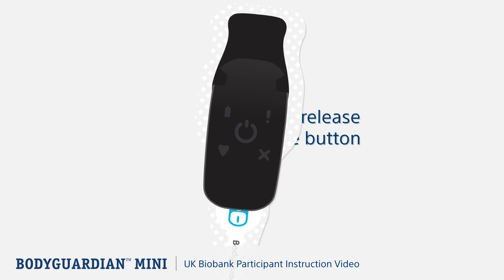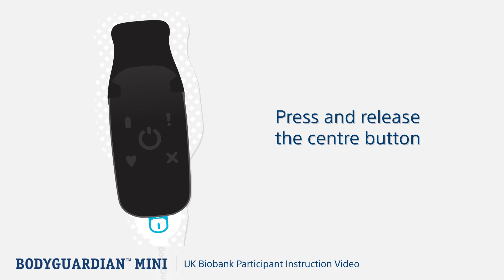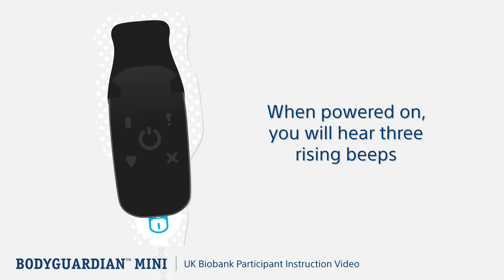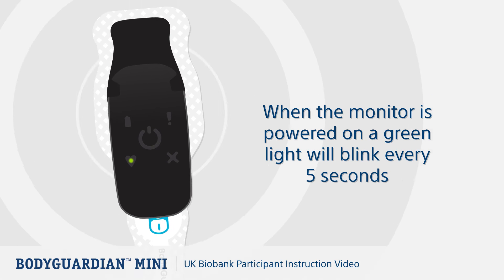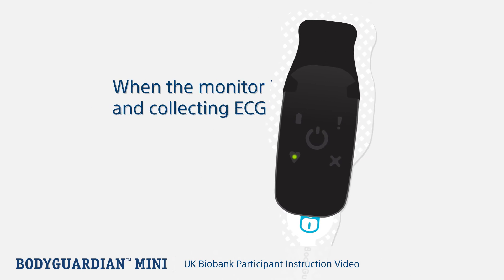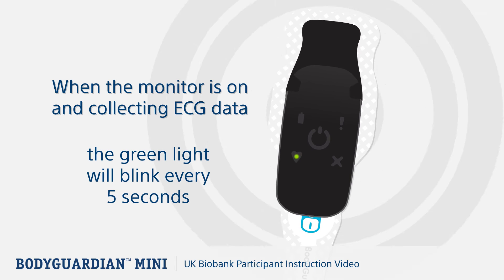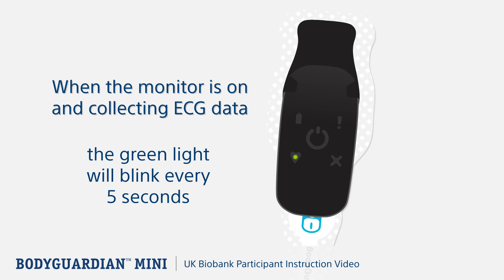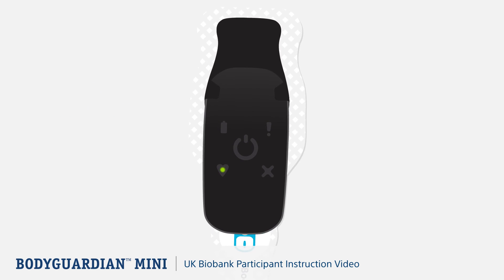Now let's look at turning on the monitor. Press and release the center button on the monitor once. As the monitor successfully powers on and contact between the strip and your skin is satisfactory, the monitor makes a quick series of three rising beeps and the green light blinks every five seconds — you're successfully monitoring. The monitor is designed to be unobtrusive, so the lights are faint.